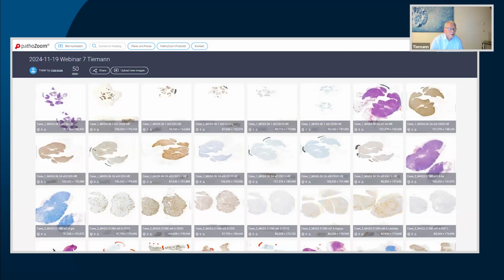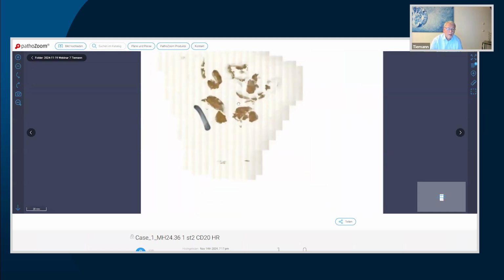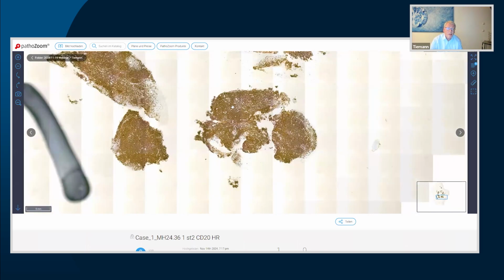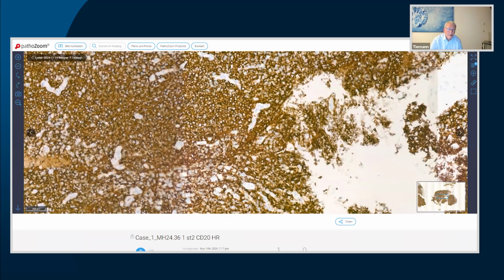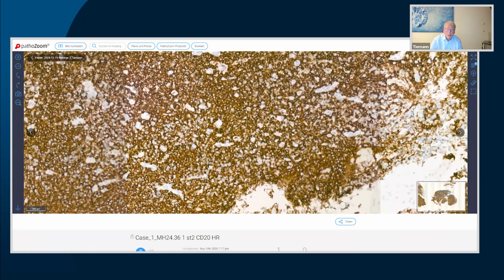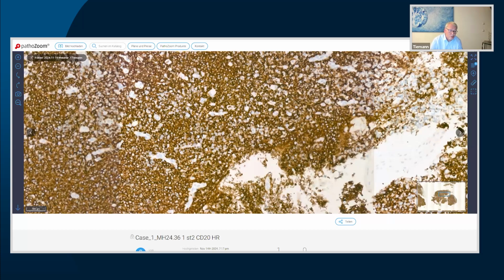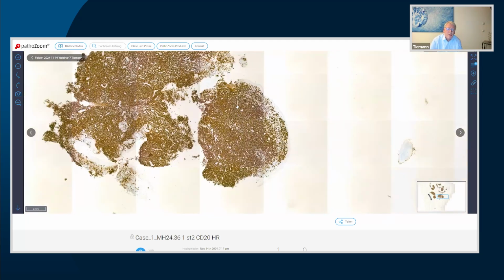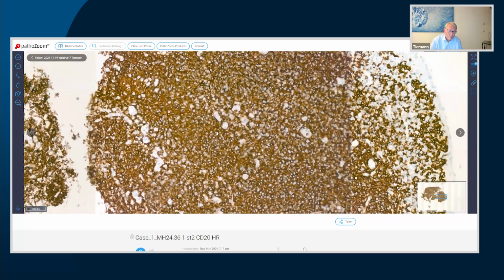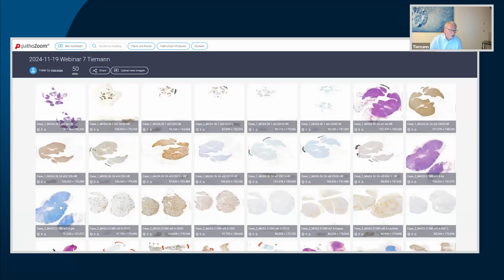So we should have at first look within CD20. This is CD20, and you see most of these cells are B cells. B cells all over the field. It's not unusual for tonsils, but we cannot find any germinal centers, or here, maybe here, this one, but they seem to be overgrown by other cells. And then we should look to the lymph node.